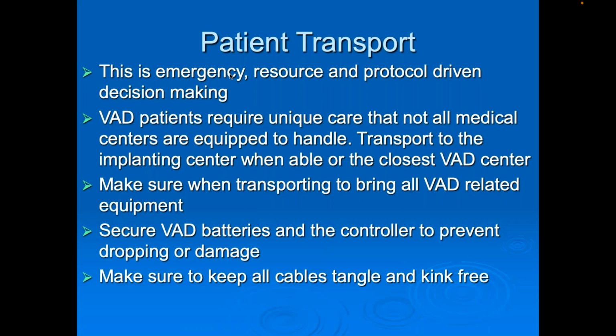Make sure when transporting to bring all VAD-related equipment, secure the VAD batteries and controller to prevent any dropping or damage, and make sure to keep all cables tangle and kink free. If the patient is stable or unstable, we're still going to transport to the closest facility, and they will arrange transport from there.